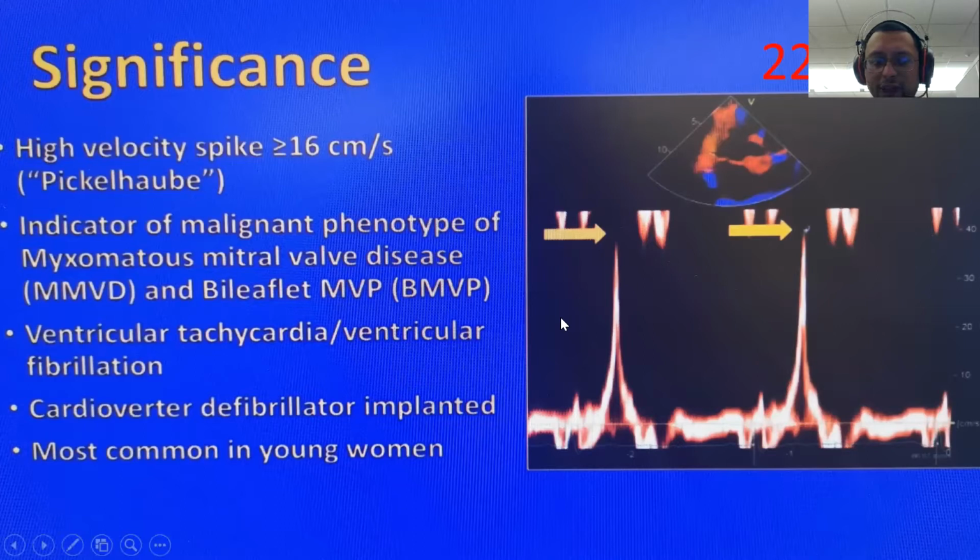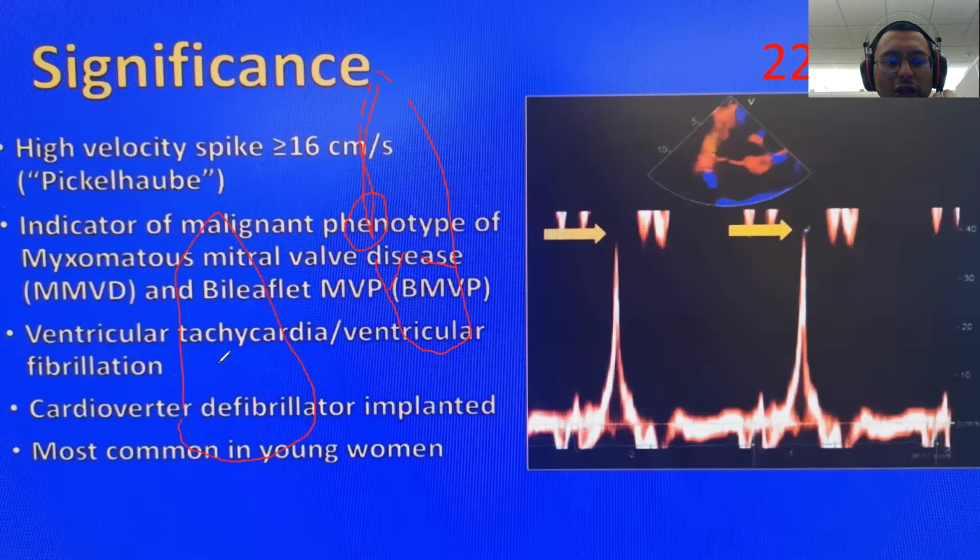Can I ask something? This is tissue Doppler at where? At the lateral wall. There are a few sides you can do. Let's say this is a 2-chamber view, you can do this side where the insertion of the papillary muscle is. Or if this is a 4-chamber view, you can also put it at the side adjacent to the papillary muscle. So that's where you do it.